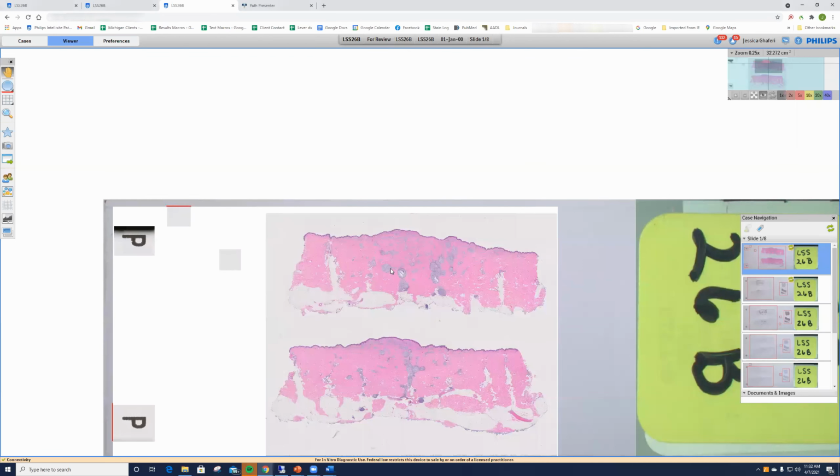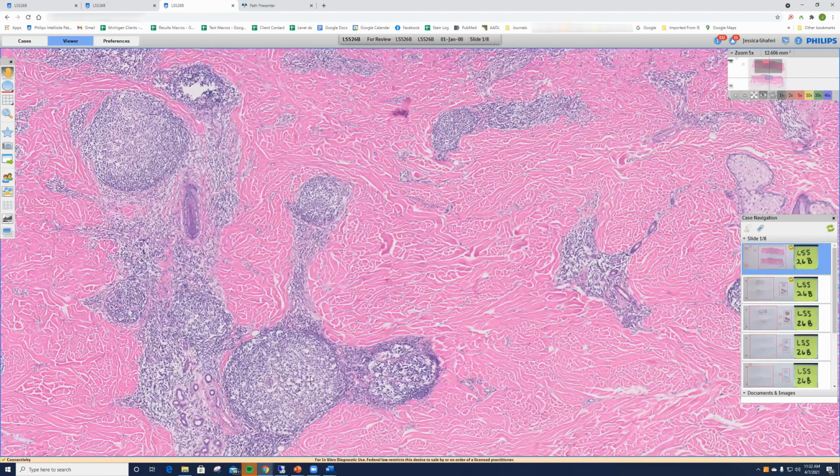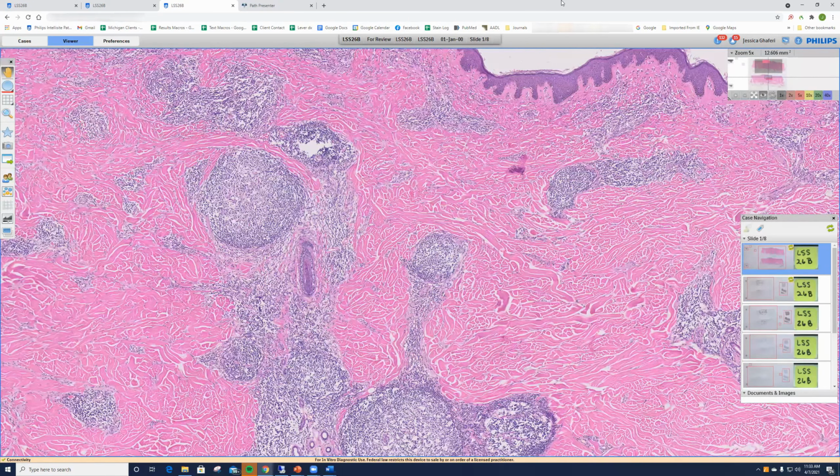And I also just wanted to mention for these cases that Ki67 within the neoplastic follicles is often scattered throughout the entire infiltrate or is only moderately elevated in these germinal centers at about a rate of 50%, whereas in a reactive lymphoid follicle, in these proliferative germinal centers, it's often going to be much higher. The Ki67, or MIB1, the other name for Ki67, is going to be much higher in a reactive lymphoid follicle. So important to know for that.